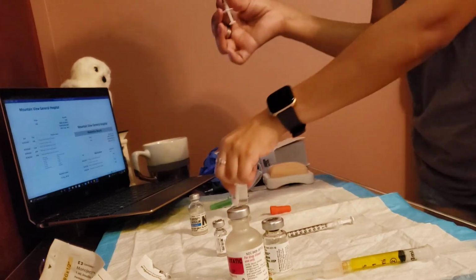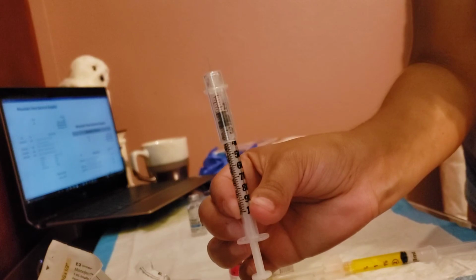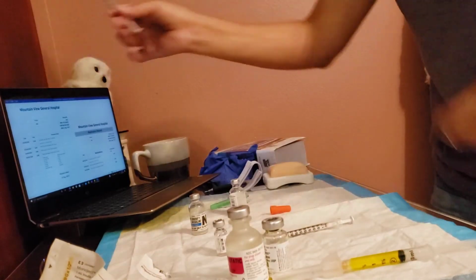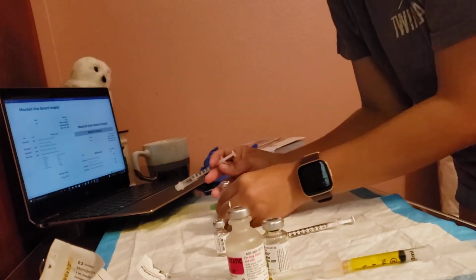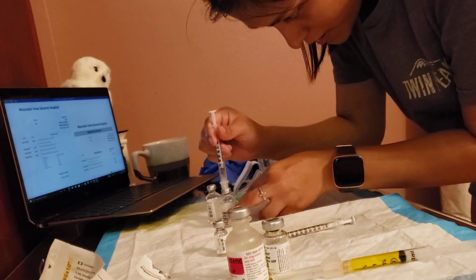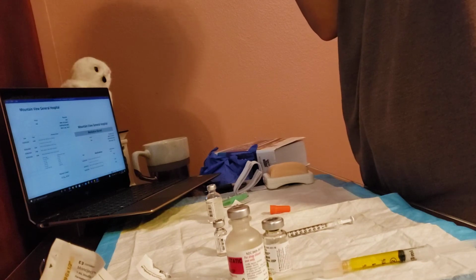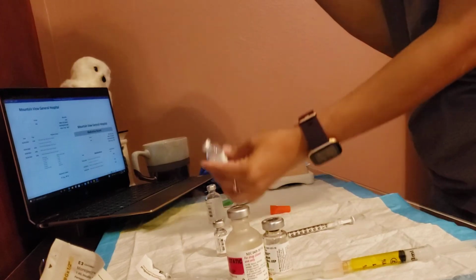And I'm going to verify my 12 units with another nurse. Then I'm going to come back to my NPH and grab another 12 units, and go down to 24. That's my 24.